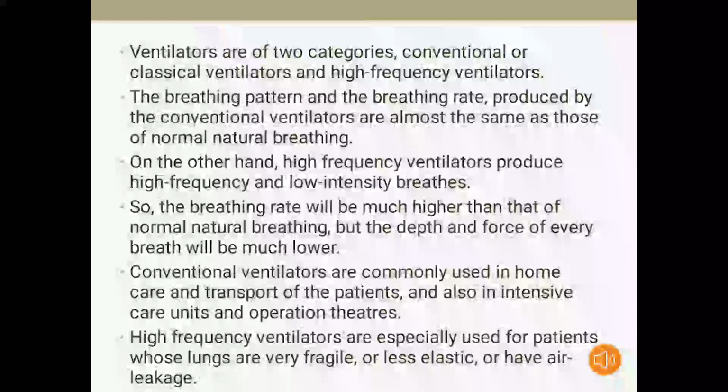Conventional ventilators are used in ICU, operation theater or in home care or for the transportation of patients. The breathing rate and the breathing pattern produced by these are almost the same as that of normal natural breathing.